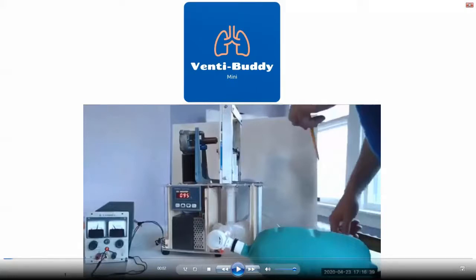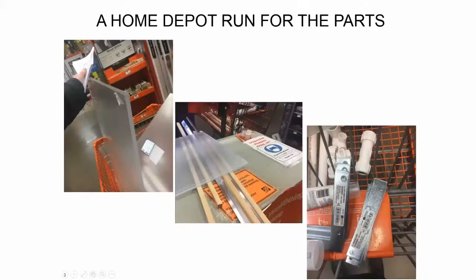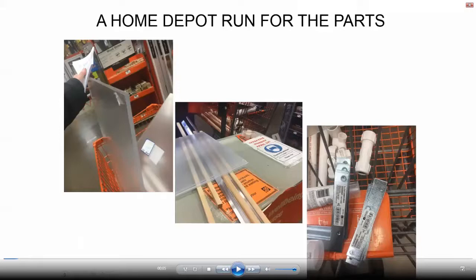Here is the latest version of our ventilator, which I just finished building a few days ago. The ventilator designs I'm focusing on are simple, cheap, and most importantly, they of course need to work. Simplicity in its electrical and mechanical design allows for emergency repair in the field. It also means, all other things being equal, less can go wrong. The construction price is in the $100 range with readily available parts from Home Depot, as can be seen being purchased here. What I'd like to do now is take you on a brief time-lapse tour of the latter half of the last 4 weeks.